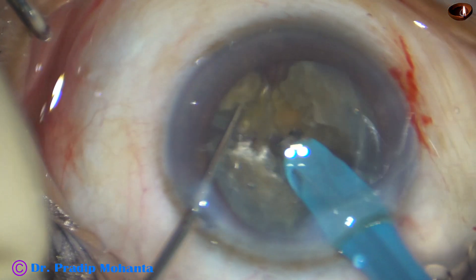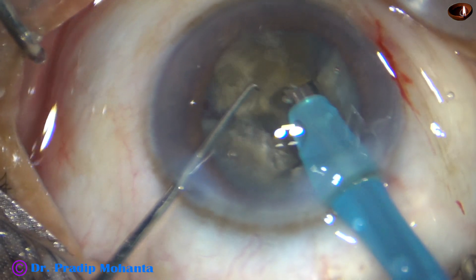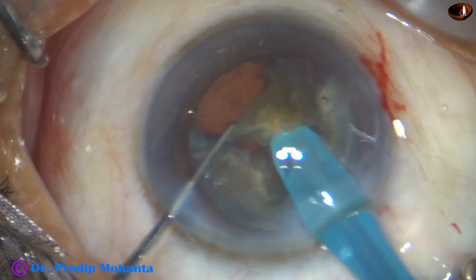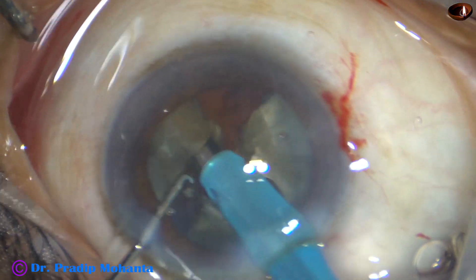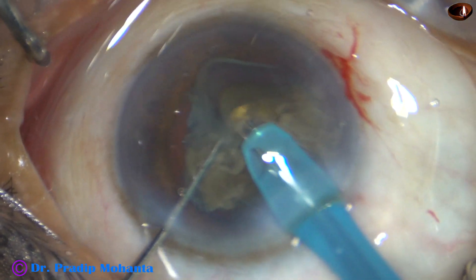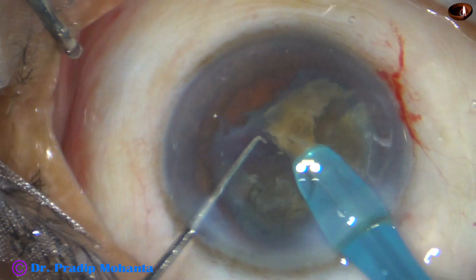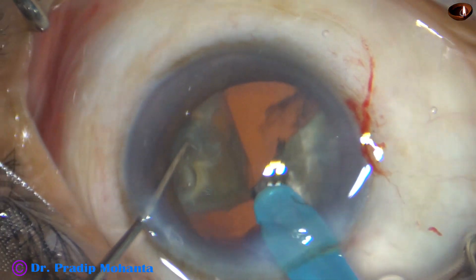Each large triangular fragment is tilted and emulsification of these large fragments is started from its apex. Sometimes it is subdivided into smaller pieces. Most of the time the chunk remains at the tip and doesn't go here and there. This technique is very good for the cornea because we deliver the ultrasonic energy within the substance of the nucleus and not in the anterior chamber.